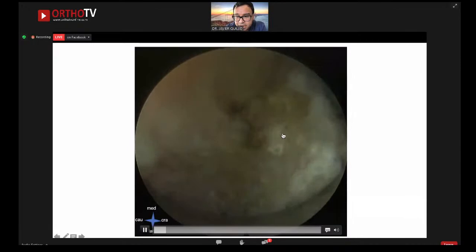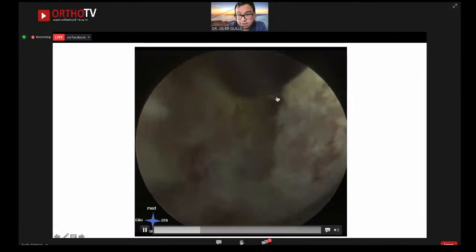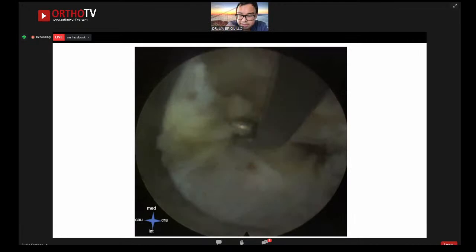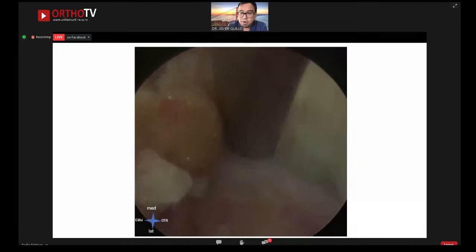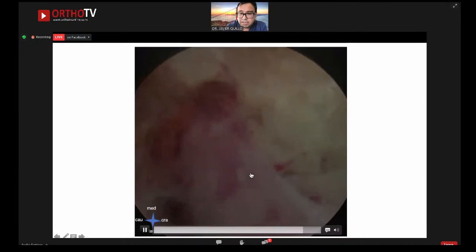We clean the soft tissue and then perform a keyhole exactly in the base of the spinous process, because this is the door that lets us cross the midline. Then we can reach the contralateral side and only detach the flavum and complete the bone decompression in the contralateral subarticular area without touching or damaging the ipsilateral flavum or other stabilizing elements of the spine. Then you can see in the video, finally, the L5 nerve decompressed.